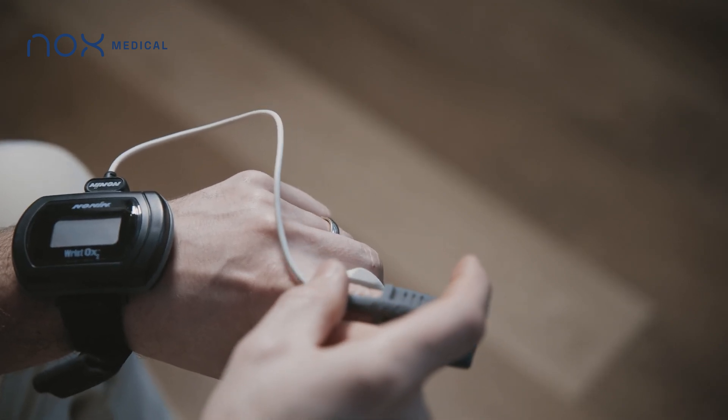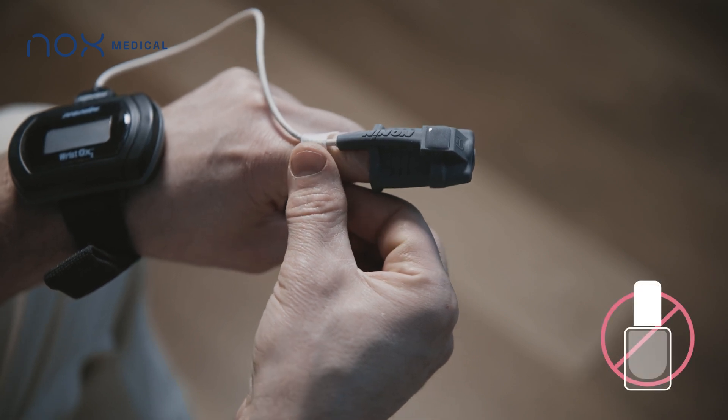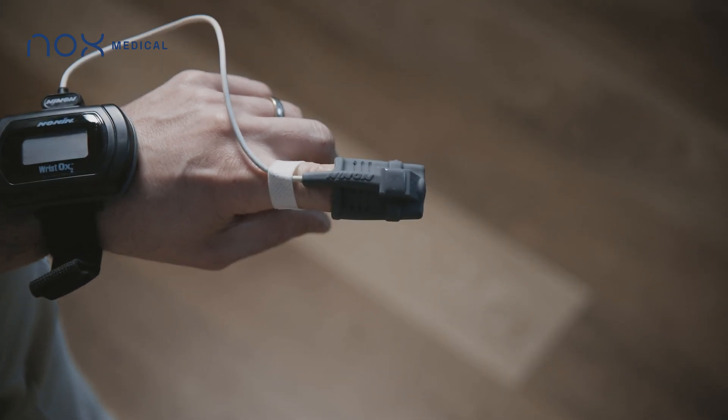To ensure an accurate reading on the pulse oximeter, remove any nail polish from your fingernail. It is okay to change fingers during the night.